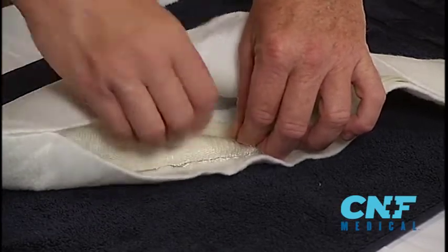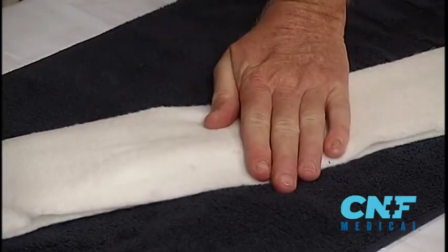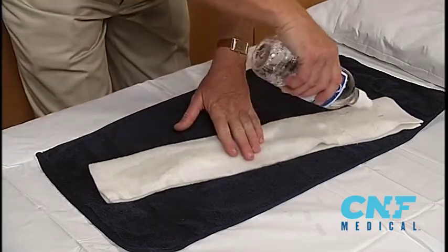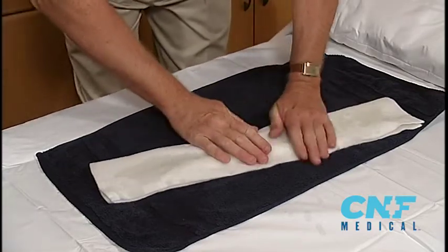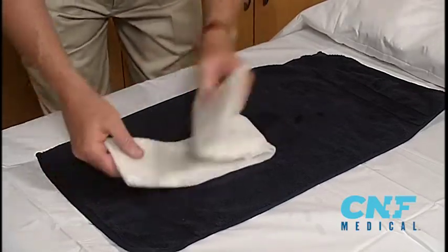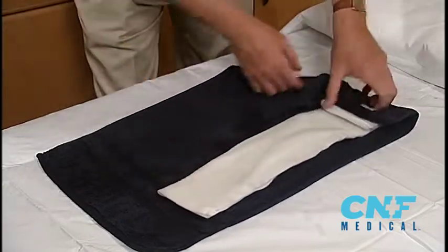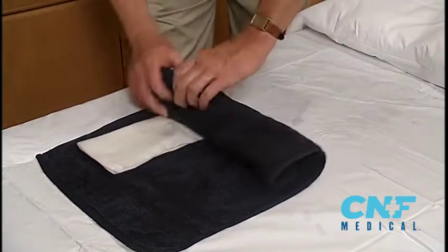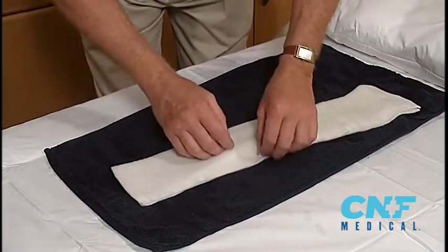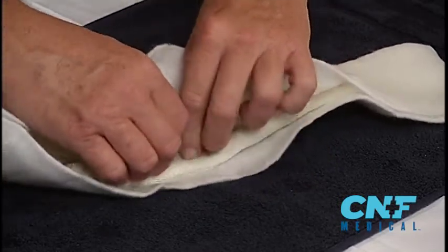Now I'm going to wet this — a little bit of zigzag on a four inch. Still just to one side. Fold my splint once and twice. Squeeze that water through. Now remove the excess with your towel — this is very important. You don't want it going on really wet; that just enhances more chance for skin maceration. Sometimes this may spread apart with all that movement, so open it up and make sure it goes back to the center seam again. Now you have a nice hourglass shape.